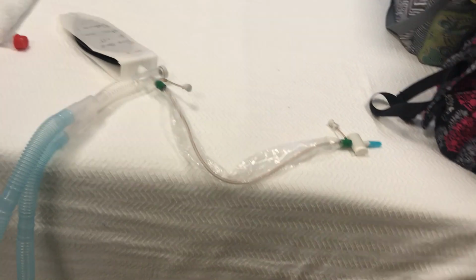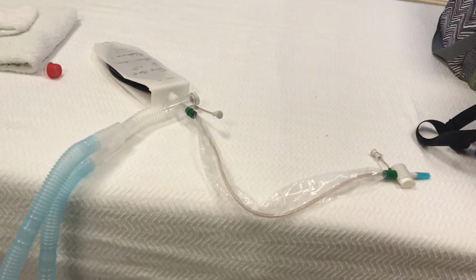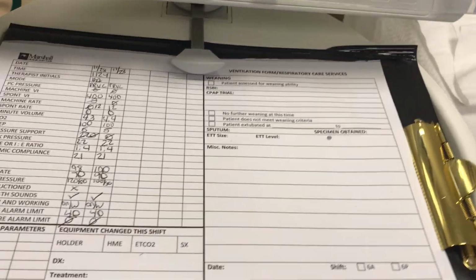I'm going to do a patient ventilator check, so I come in the room, introduce myself, and get gloves so I can assess my patient. Suction the patient if they need it. And then I would come over to my vent and I would start checking it.